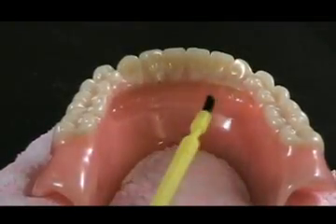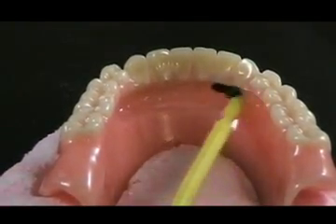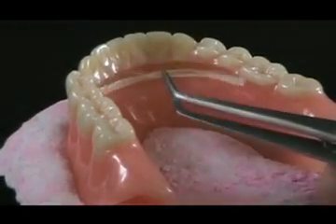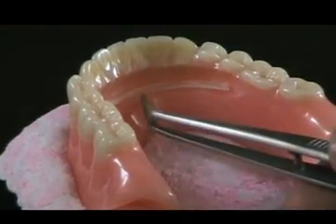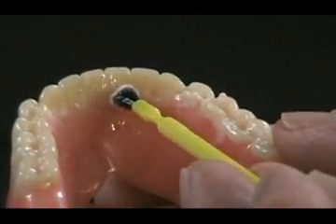Paint a small amount of E-fiber adhesive in the prepared groove. Reposition the light-cured E-fiber reinforcement in the groove. Prepare a mix of self-curing acrylic resin and fill in the groove with resin.